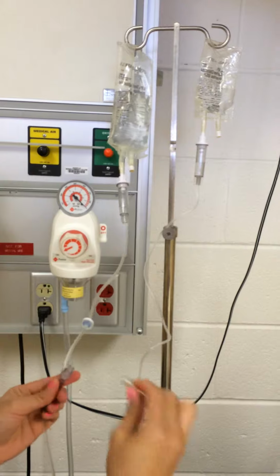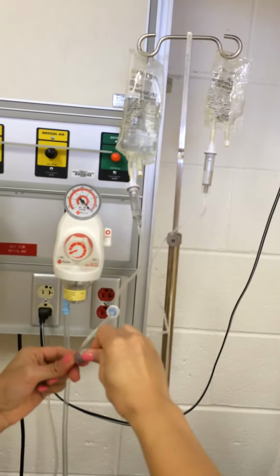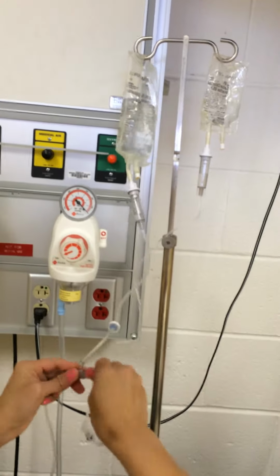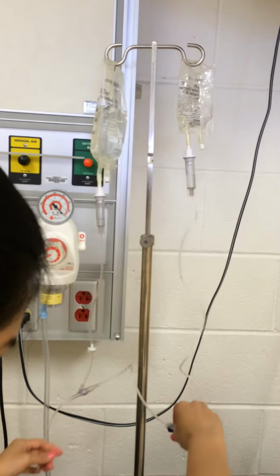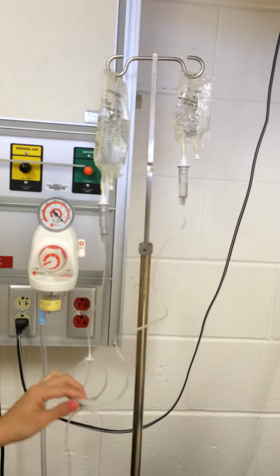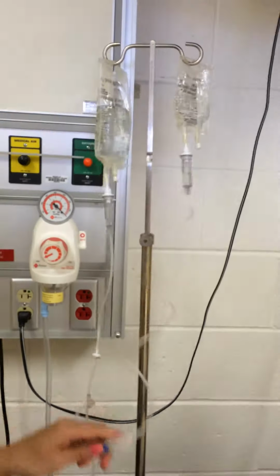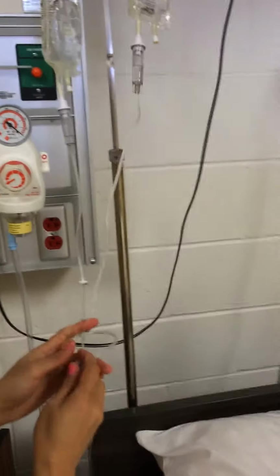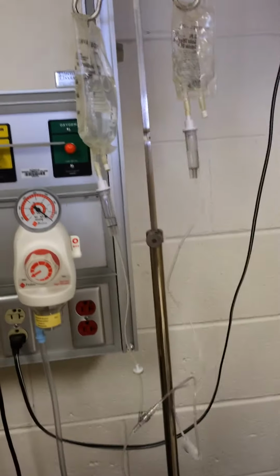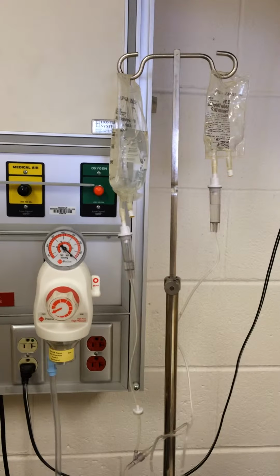And I am going to attach it to the primary solution. So after I connect it to the primary solution, I open it all the way up, and I recalibrate the drip rate again.